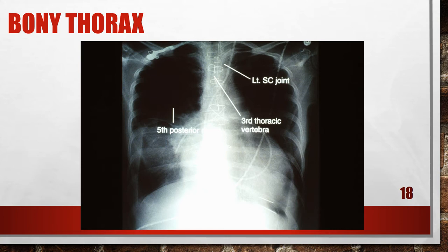This chest x-ray is angled too far cephalically, and it's looking a little more like a lordotic chest. If you see the ribs squared off, that means your central ray angle is too far cephalic. Plus, this patient's apices are cut, so that needs to be fixed.